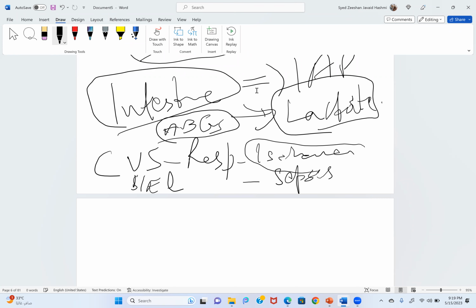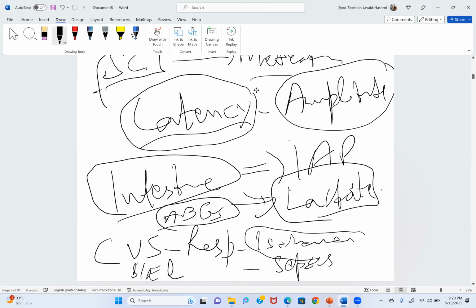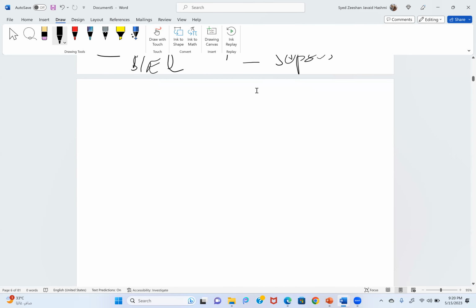For example, there is hypertension, ischemic heart disease, high risk surgery, the patient suddenly bleeds, there is no hemoglobin. Now how would you monitor the heart? The first answer will be ECG, the other answer will be echo, for example. And there are certain other things, as I told you: enzymes, other cardiac output monitors, and CVP, like this one, mixed venous oxygen saturation. There will be so many things which will tell you the situation of the heart and the perfusion of vital organs.